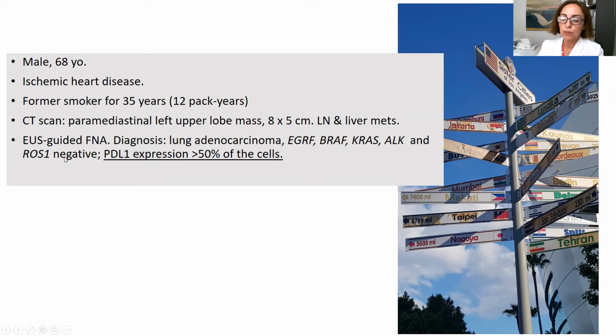We performed an IDYLLA analysis because it was requested by the oncologist, since the patient was in very bad condition and the oncologist wanted to know as quickly as possible if there was any possibility of targeted therapy. And we found a PD-L1 expression higher than 50% of the tumor cells of this patient.